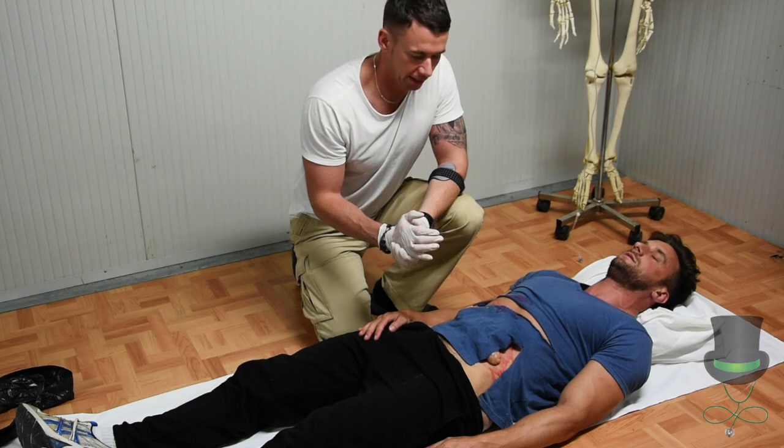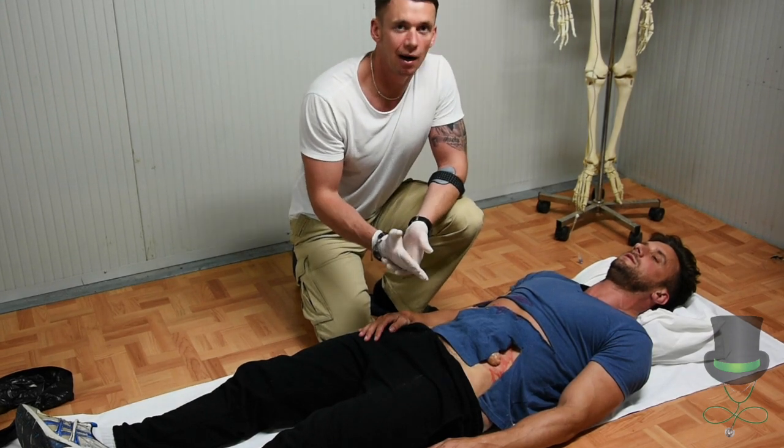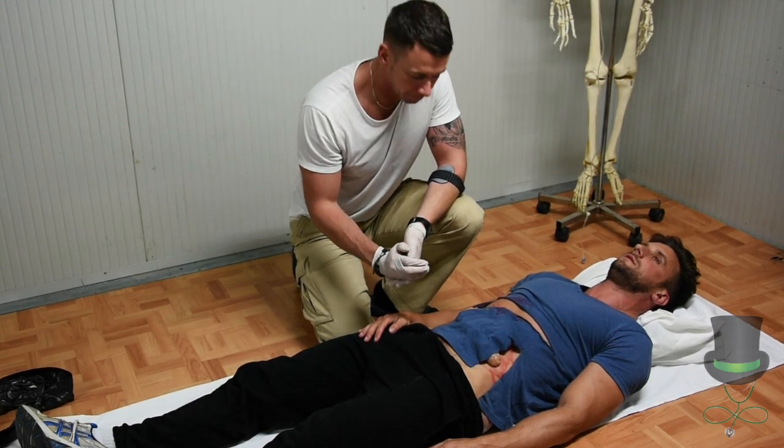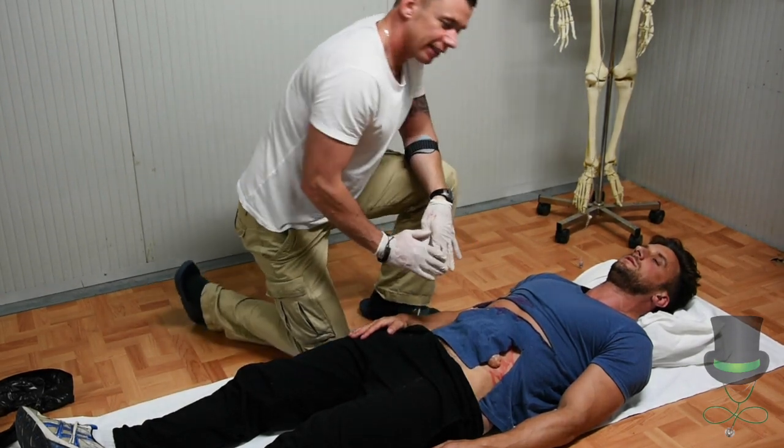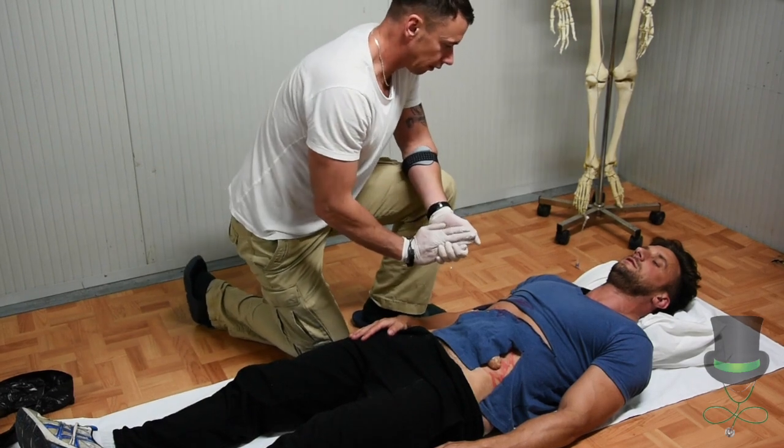Hi, I'm Anthony and I'm a paramedic. Today I'm going to demonstrate how to treat an evisceration. First thing we need to do is observe safety and universal precautions — ensure you are wearing your gloves.